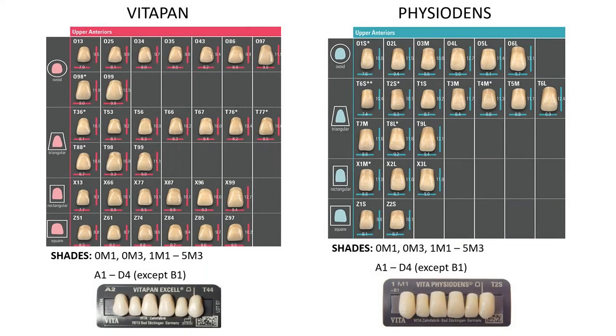Multiple molds, obviously. Like all denture companies, everyone's gone wild with a different mold for individual patients, all by averaging, all by looking at the measurements of that individual patient. That's great. But again, those are the outliers for some of these denture molds.